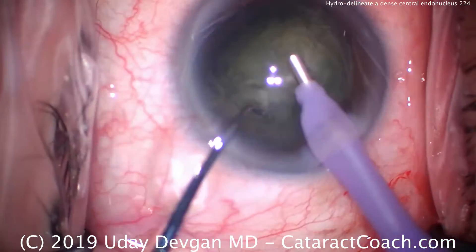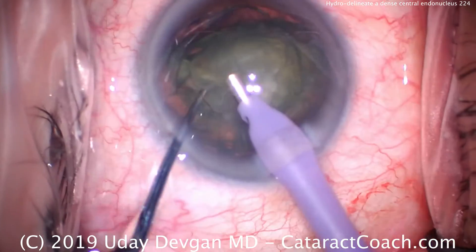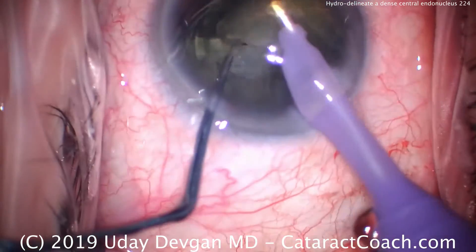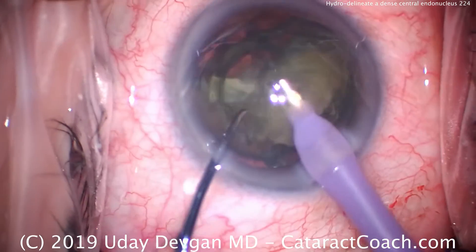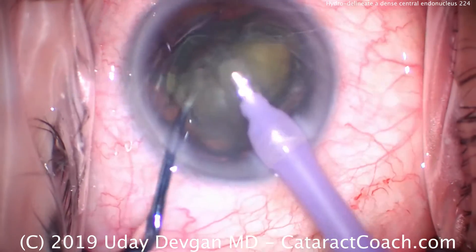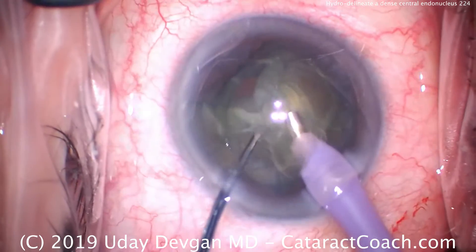We did one chop to divide it in halves, and then one half was split into two quarters. We're now using the phaco probe just to remove that, keeping the nuclear piece in front of the phaco tip and taking our time. This is a little bit denser than we expected, so we have to increase our phaco energy or just be patient with the phaco probe.